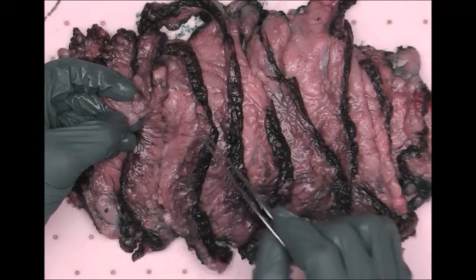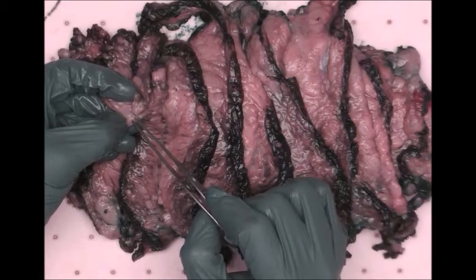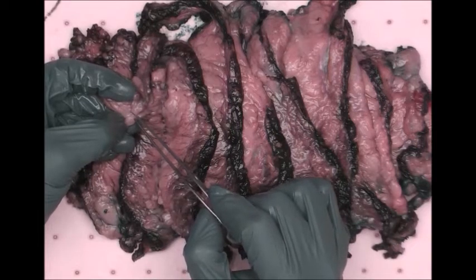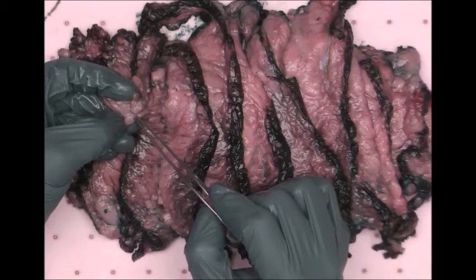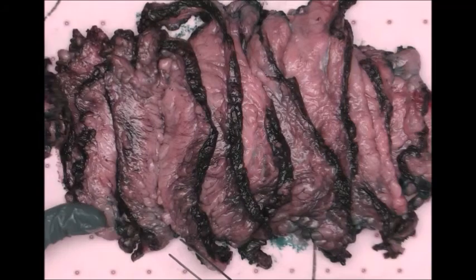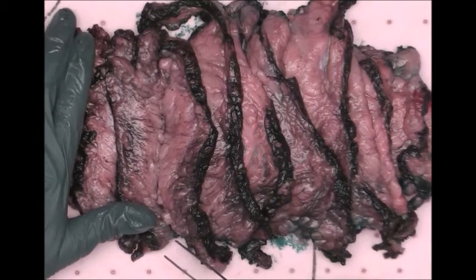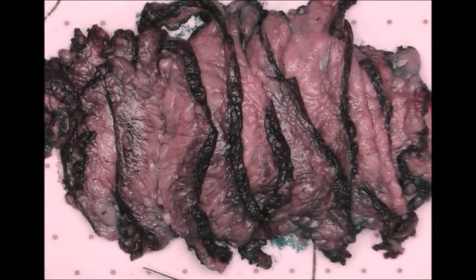So we've got a marker here, marker here. This marker is associated with the mass. This marker is associated with either a tumor satellite nodule or a grossly positive lymph node because it's so indurated. Okay? And then as I palpate at the very end of the case, I'll check for any additional lymph nodes here. We'll zoom out for a second.